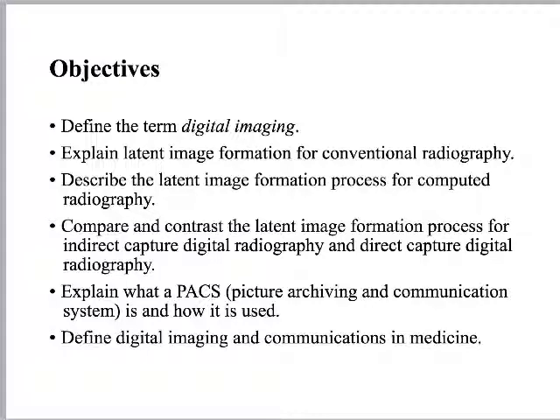I'm saying it's the umbrella term, and underneath this big umbrella term of digital imaging, there hangs the two other kind of smaller terms, which are computed radiography and digital radiography, right? And then beneath digital radiography, we have direct capture and indirect capture. If you understand that kind of big picture, you're well on your way towards getting the big takeaway for today.